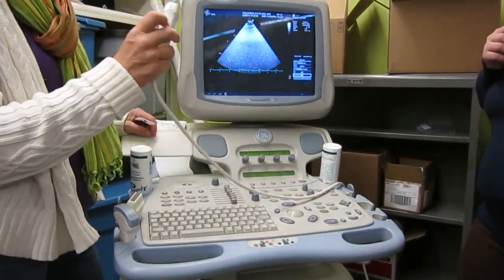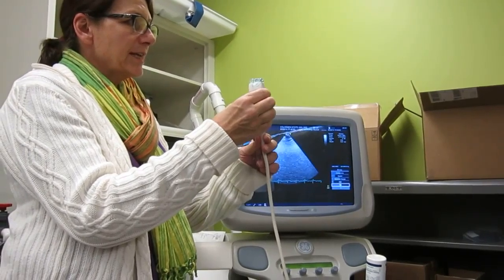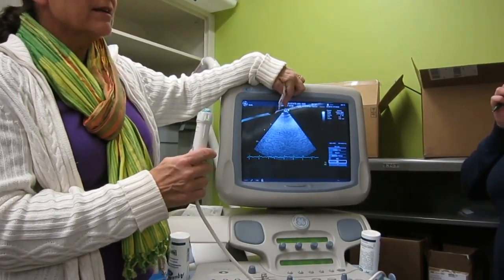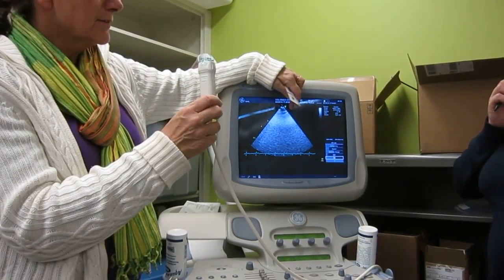Every transducer has a reference mark. On this one, it's this green light and this ridge. You can actually feel it when you're scanning, okay? And so this line and light represent that mark. Whatever I point that at will be on this side of the screen, okay?